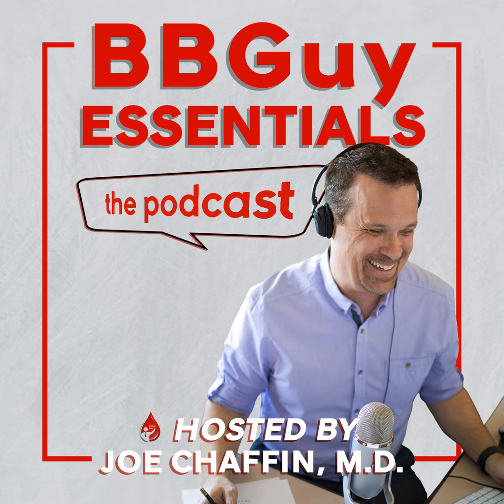All right. So, Jill, we've talked about a scenario where everything appears incompatible. However, we have a positive autocontrol and a positive DAT, and we've worked through that, saying we're trying to deal with the fact that this could be, and in fact was in our case, a warm autoantibody. So let's go back to our friend Frida Johnson. And Frida, like many comic book characters, exists in many different planes. So let's imagine an alternate reality where Frida comes into the hospital with the same bleeding esophageal varices that we talked about before, the same initially fairly benign vital signs and the same ABO and RH results.